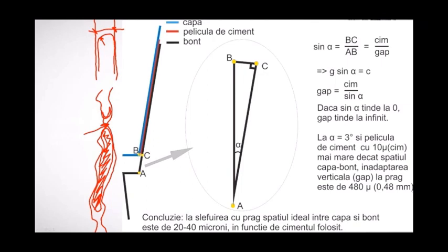You have to have the space, the right space for the cement. So the problem is there, no matter if you have the shoulder or don't have the shoulder. You need the space for the cement. So you don't have to have a lot of space for the cement, but the right space. So supposing it's 40 microns, you need 50 microns. Yeah, 50, 60 microns, that's it.